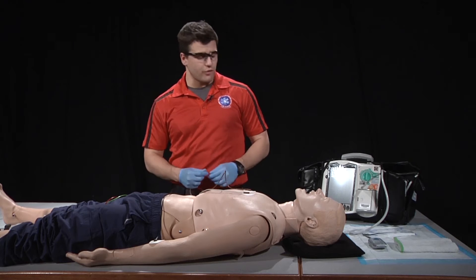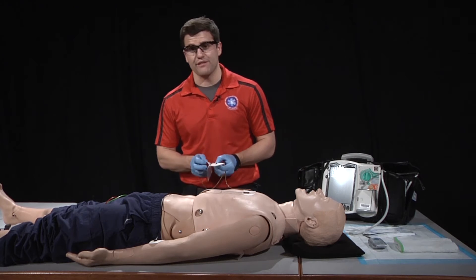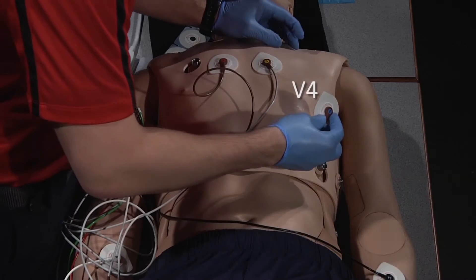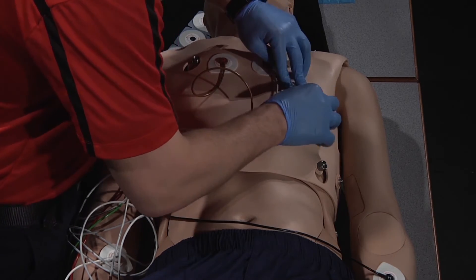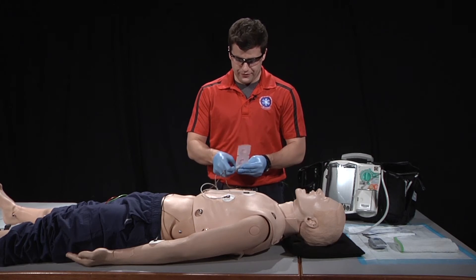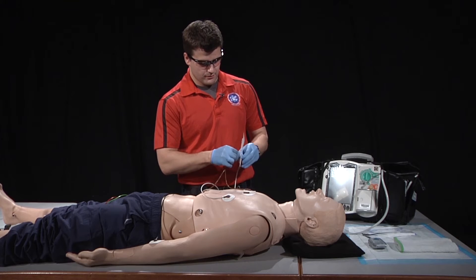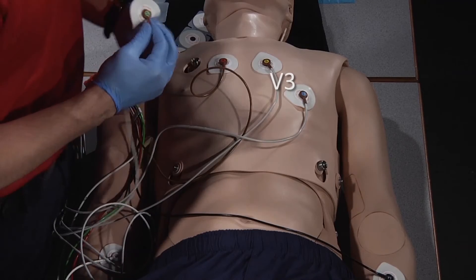After V2, we'll be placing V4. V4 will be placed midclavicular in the fifth intercostal space. After that, we'll place V3. V3 will be placed midline in between V2 and V4.